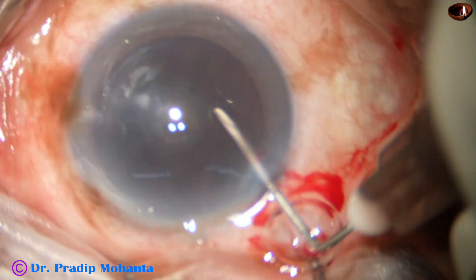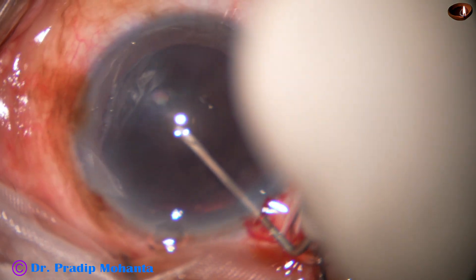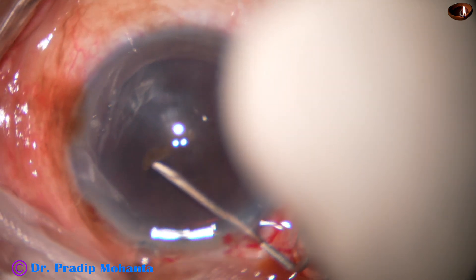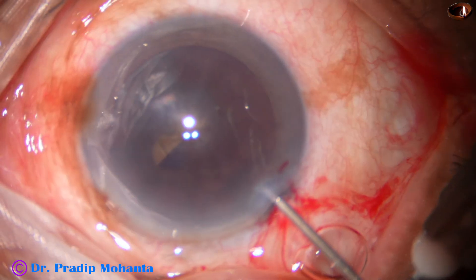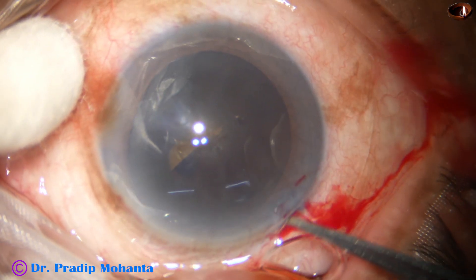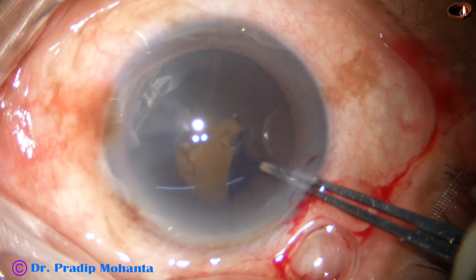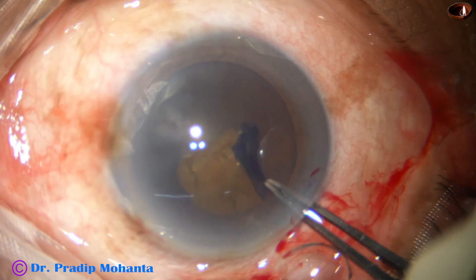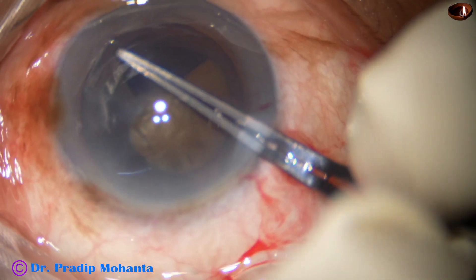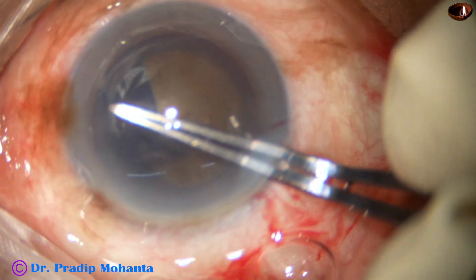If we do a large rexis, nucleus management becomes easy and the chance of posterior capsular rent and risk of zonular dehiscences are all reduced drastically. I am doing a large capsulorhexis with the help of utrata forceps.